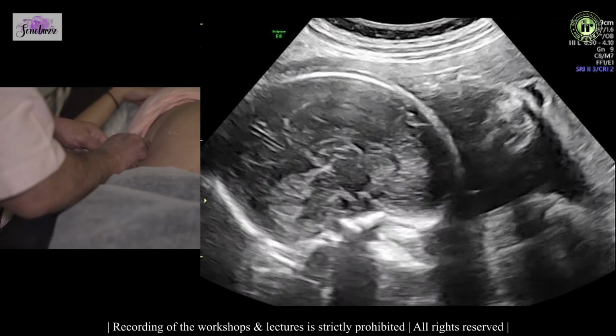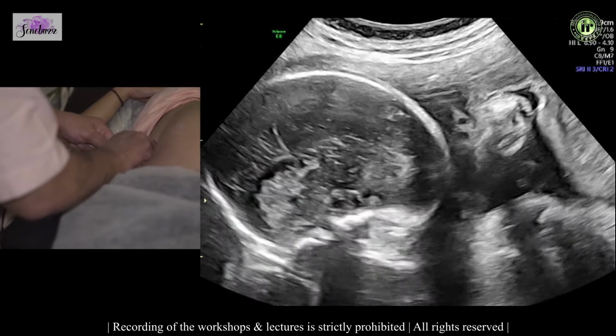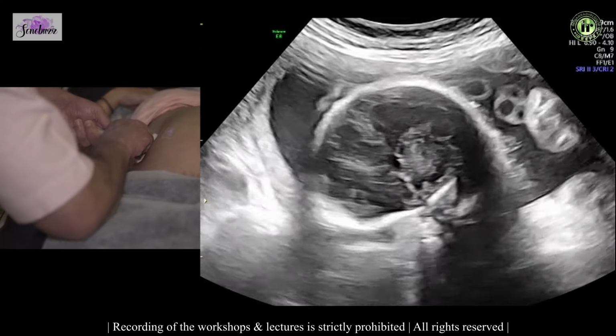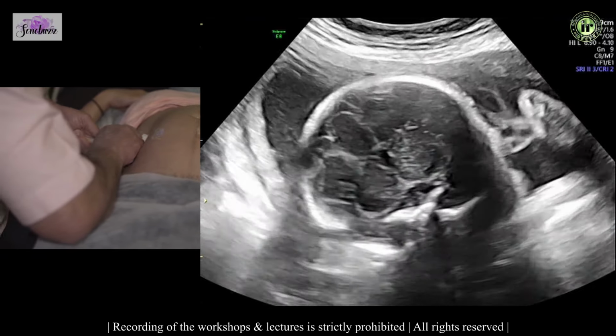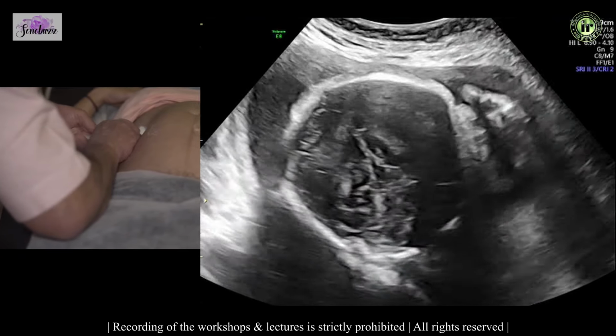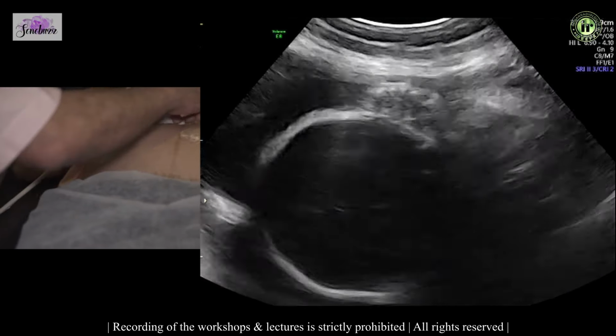So that is the sagittal plane, 3 sections in the sagittal from one side to the other, 3 coronal planes or 4 coronal planes from the front to the cavum, thalamus, and posteriorly the cerebellum, and 3 axial planes as we saw earlier.